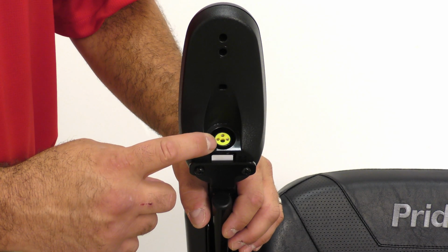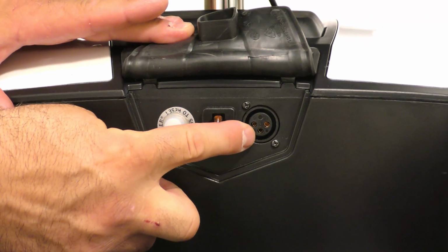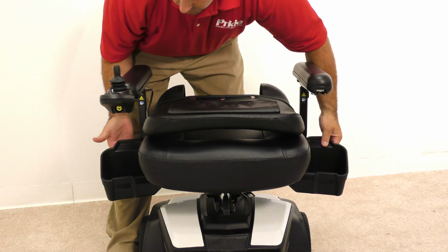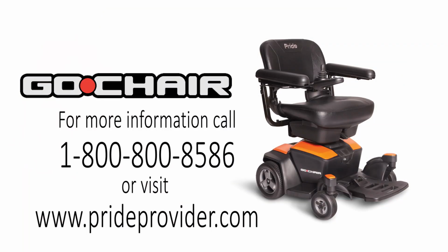Make sure the unit is fully charged before use by charging in one of the 2 charging ports on the Go chair. Please note, to remove the seat, you should put the backrest down and must open the underseat storage before pulling straight up. That is the setup for the new Go chair.